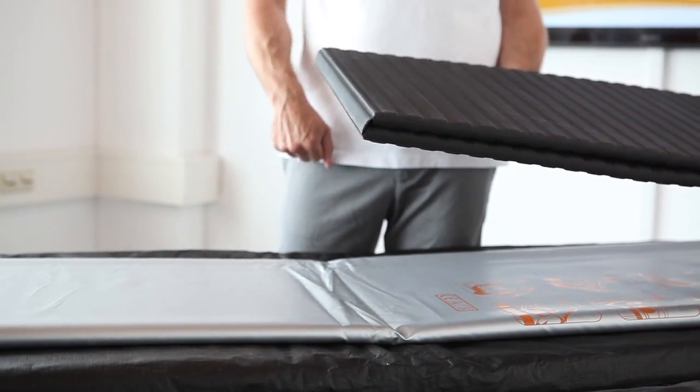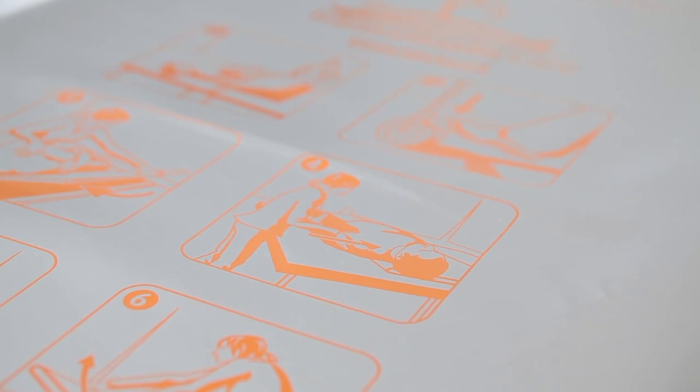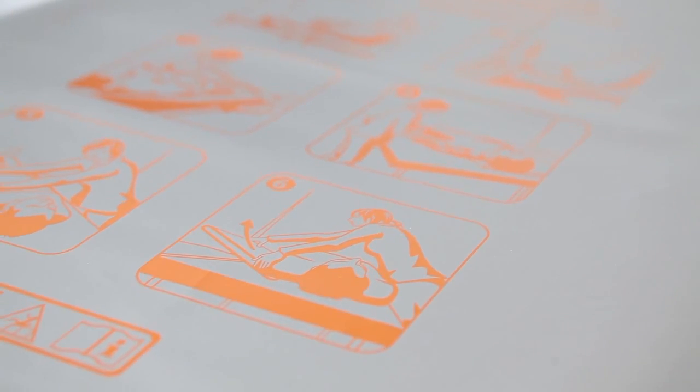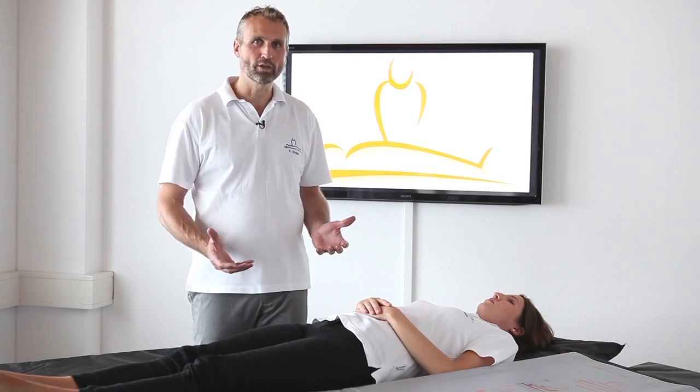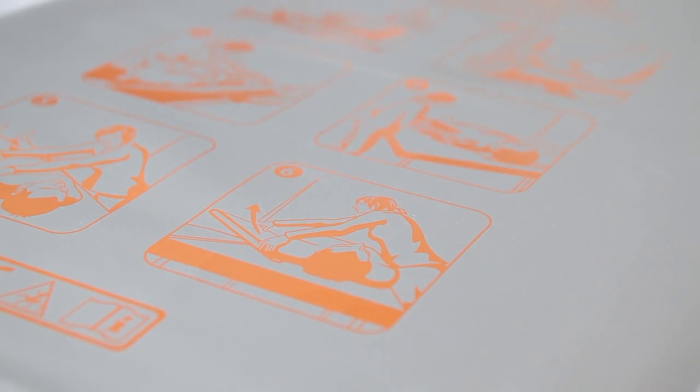So that's the body covered. Now I'll show you the complete setup and demonstrate the repositioning process. The most important merit of this product is that you don't lift the patient but shift the patient. I'm going to show you now in detail.